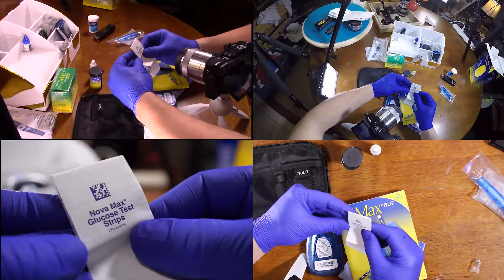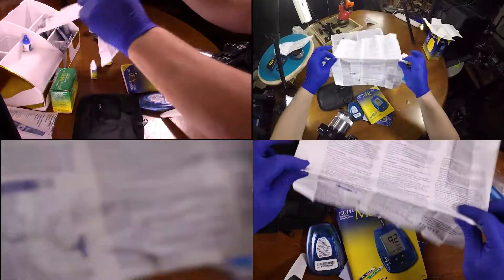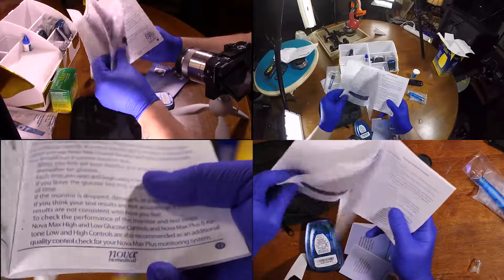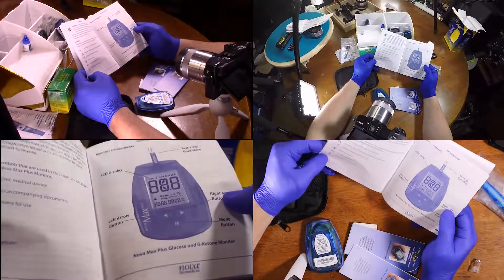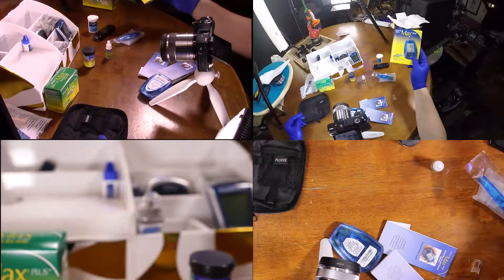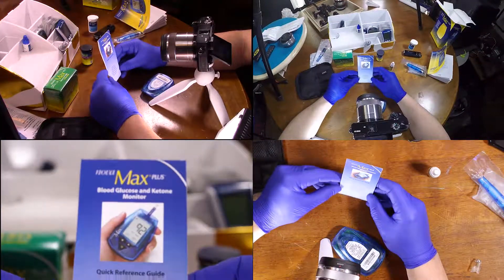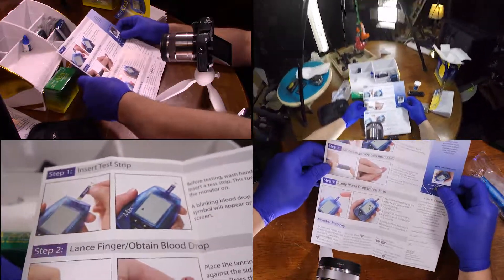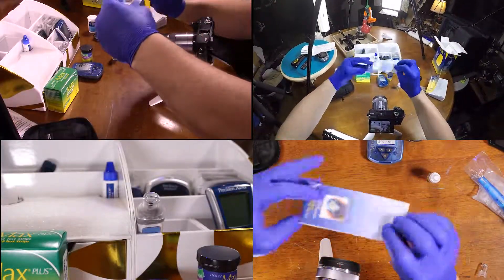Nova Max Glucose Test Strips. I believe it's referring to this guy. This one actually looks like it's got some better information. That's actually a book I would hold on to, but you could find it online. That's obviously in Spanish. This is kind of a well-laid-out diagram here — I'd hold on to this and keep it with you.